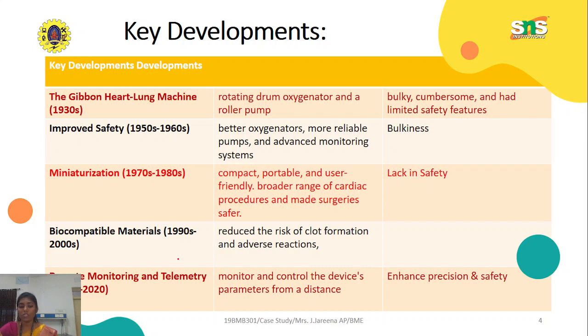The doctor can monitor and prescribe or do any treatment over a long distance. Using recent technology, they have developed a machine that has the capability to monitor and control the device parameters from a distance.